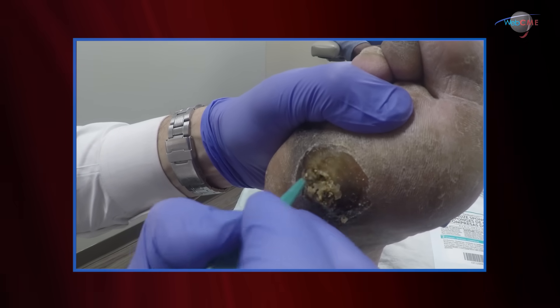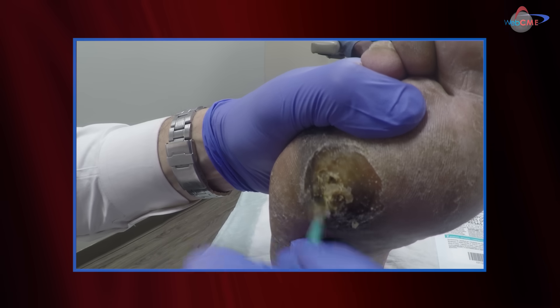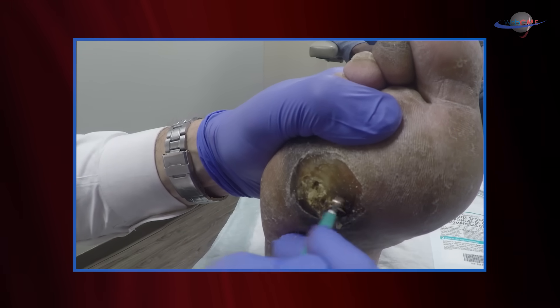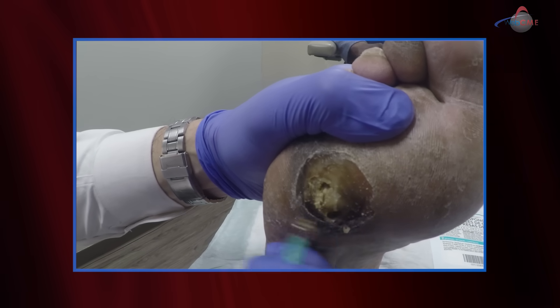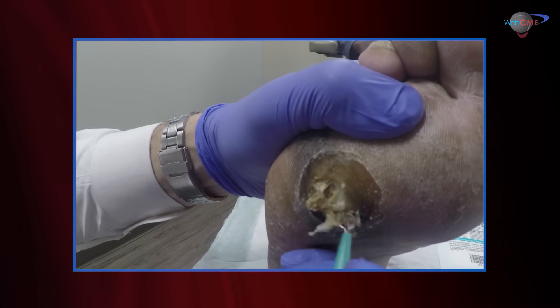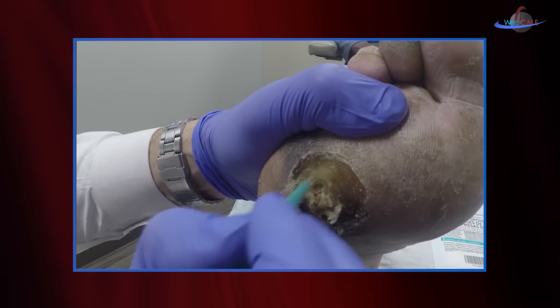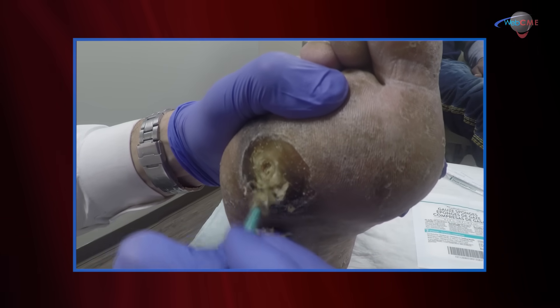I do this for a number of reasons. If you just dive into the center of the ulcer, you may get into some viable tissue that bleeds, and the bleeding will then obscure your debridement — we obviously don't want that. As you'll see, I'm raking my curette across the surfaces, slowly taking layers of the callus down, again to find the extent of this callus and determine whether there's an ulcer formed underneath it.